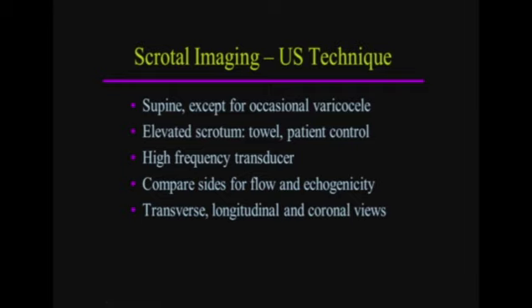Typically, the patient is examined in a supine position. Sometimes, particularly if one is concerned about a varicocele, examining the patient in an upright position may aid. Oftentimes, one can elevate the scrotum either with a towel or other device. I like a small towel surrounding the scrotum with the patient being given both ends of the small towel so they can control the scrotum and you are not responsible for creating increased pain, particularly in an individual with a painful scrotum.